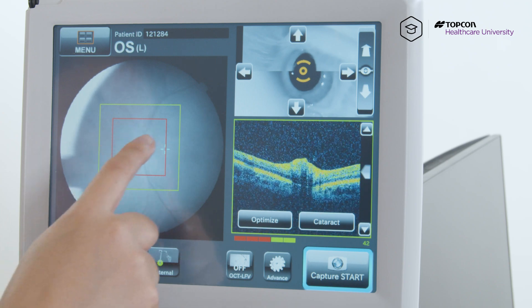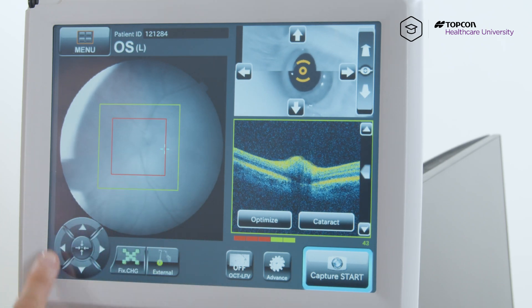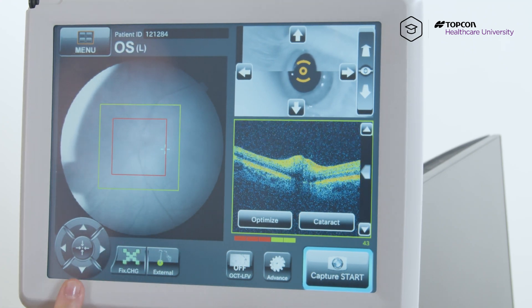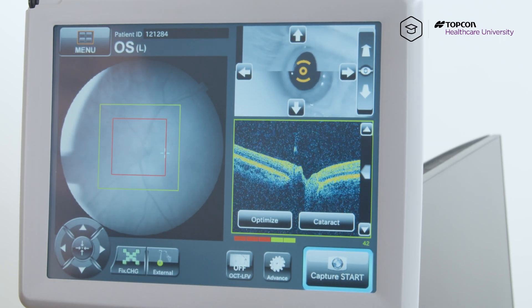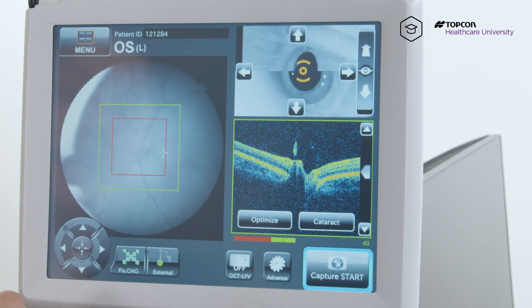So if you wanted to move the optic disc a little bit more to the center, I'm going to move that blue cross using these arrows here on the bottom in the direction that I want to move the optic disc. So if I want to move it down, I'm going to hit the down arrow here, but make sure the patient follows that green X that they see inside. If you want to move it a little bit to the left, you can hit the left arrow here.